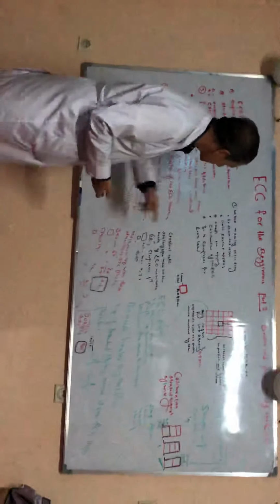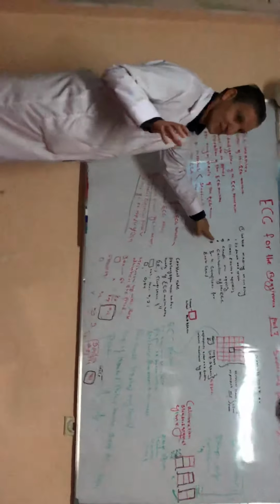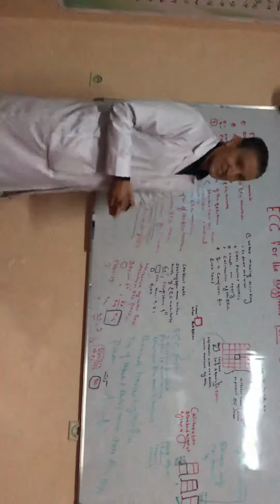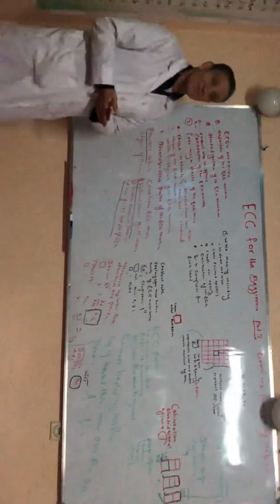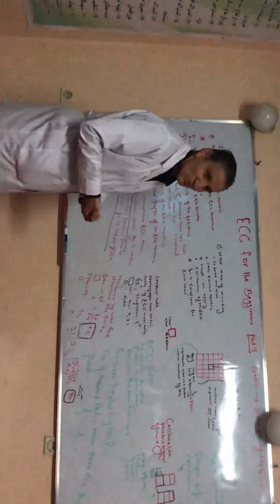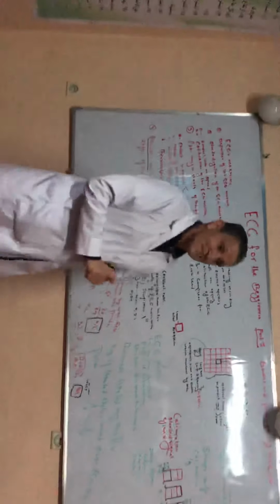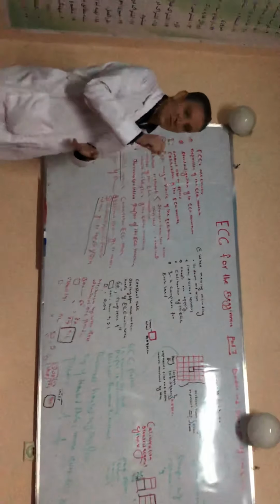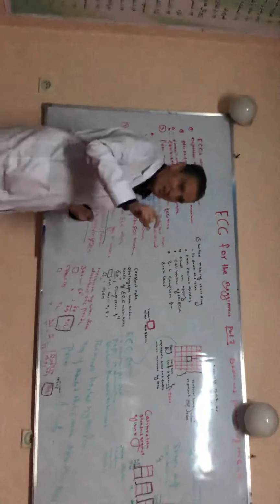The third thing that you should care about during the taking of the ECG is calibration. We should adjust a standard signal of 1 millivolt, displacing the needle of the ECG machine vertically up to 1 centimeter. For each lead, 3 or 4 complexes are sufficient. For example, when you want to record lead 1, you should take 3 or 4 complexes. Did you understand the meaning of that?